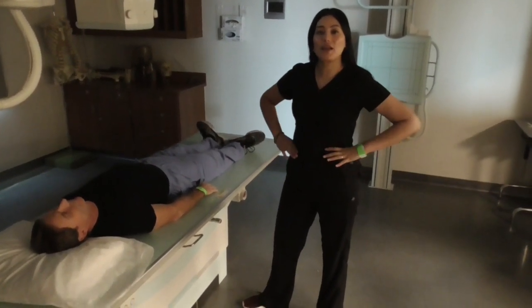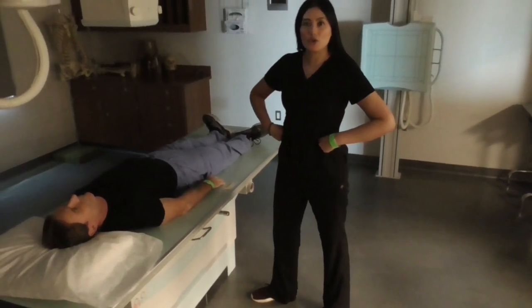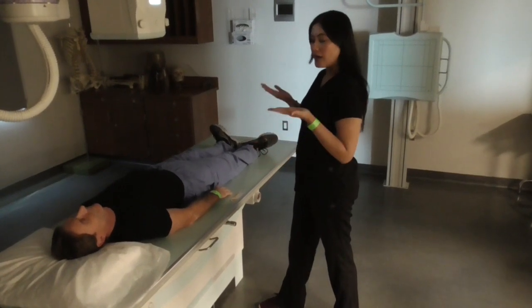We will be centering at the level of L4 or at the level of the iliac crest. Our patient is supine, face up.